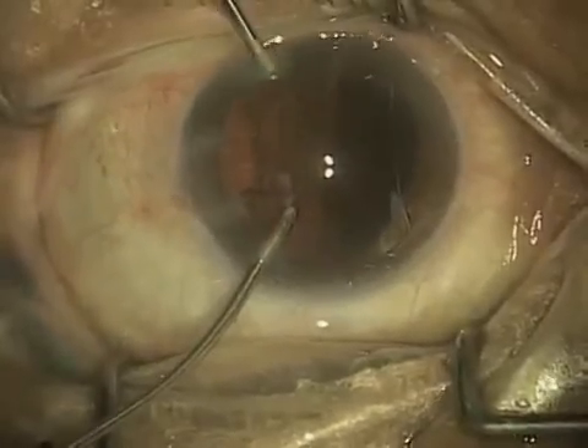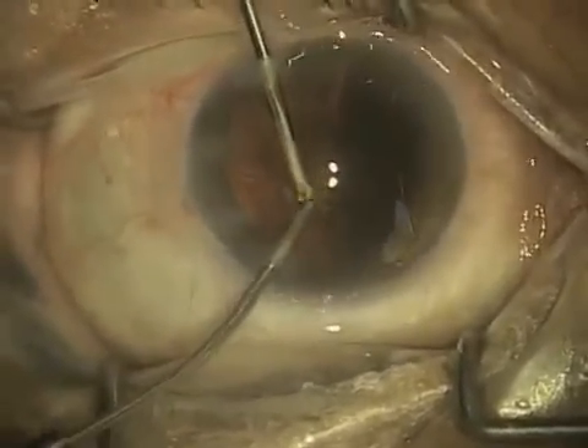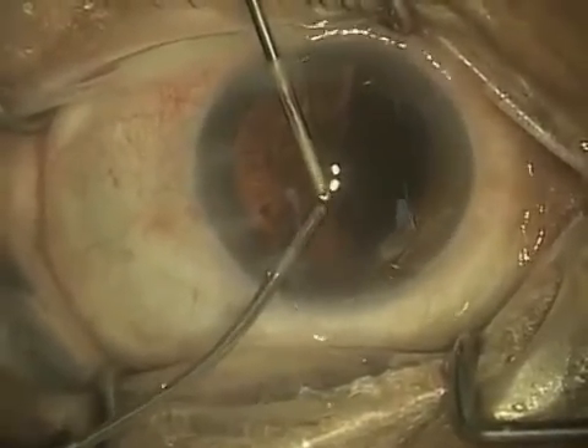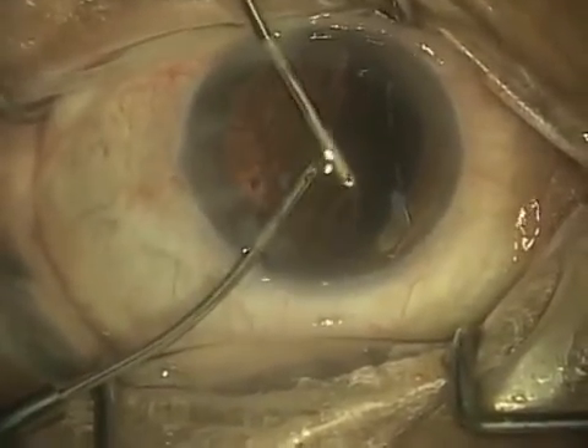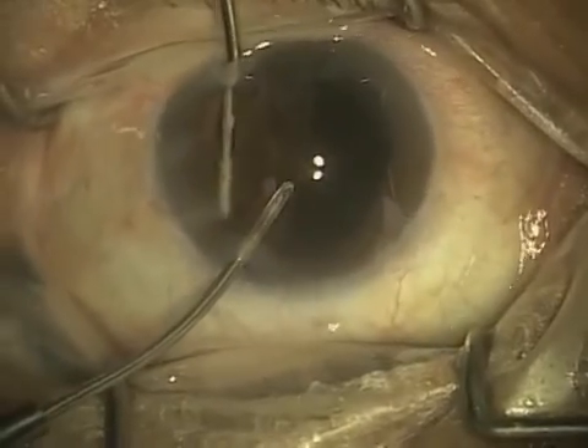First I put in the irrigating handpiece, and then up from the top of the video you see the aspirating handpiece. You'll notice that the irrigating handpiece reflects light more, and the aspirating handpiece tip looks like it's been sanded — and that's actually intentional.